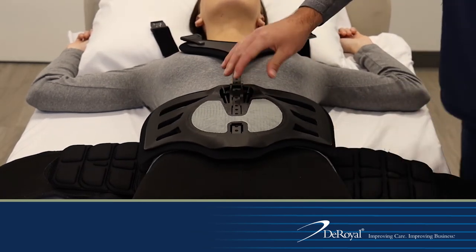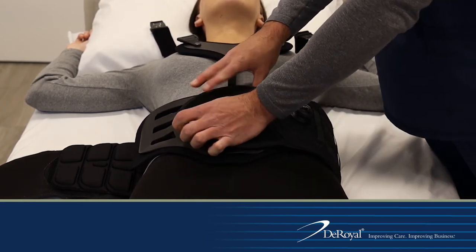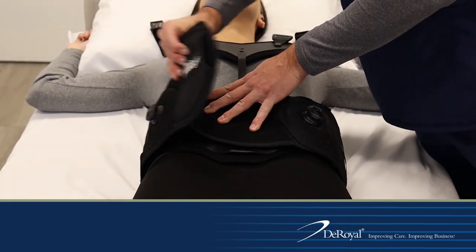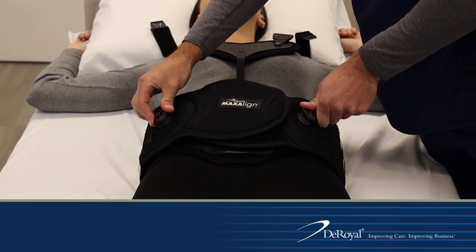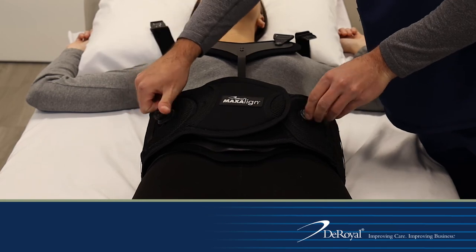Wrap the left belt arm around the patient and secure evenly to the hook section on the anterior panel. Close the belt by wrapping the right belt arm around the patient and securing evenly to the loop section of the left belt arm. Push the BOA dials in and provide compression by turning clockwise evenly.